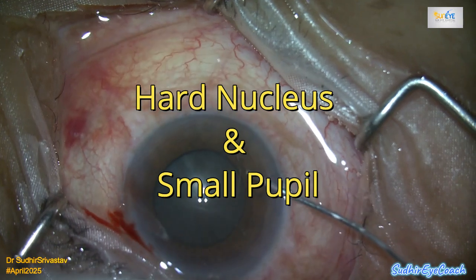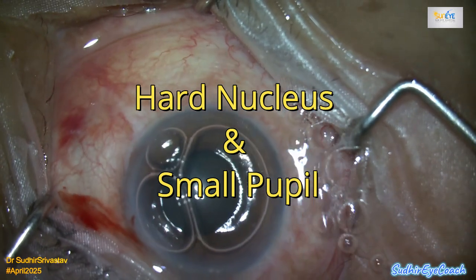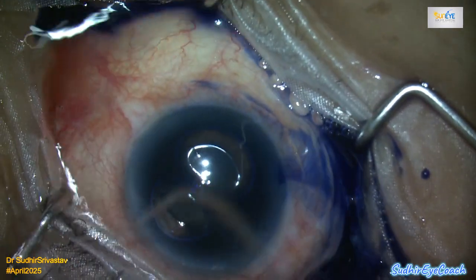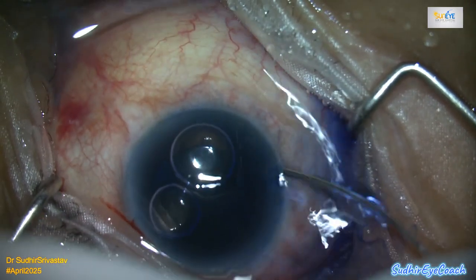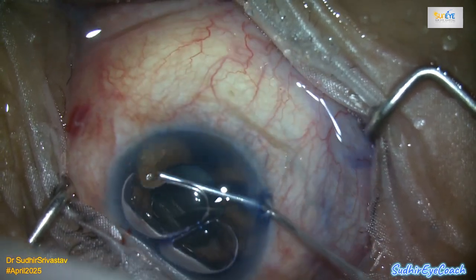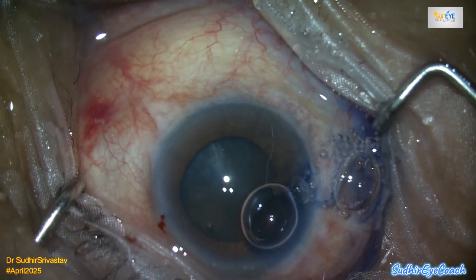This is the platform where I share videos just to give a thought if you are learning cataract surgery. So today I'm sharing a challenging surgical video involving a grade 4 or 5 hard nucleus cataract with a non-dilating pupil. Let me start by saying, for beginners, adequate pupil dilation is absolutely essential before you begin phacoemulsification.